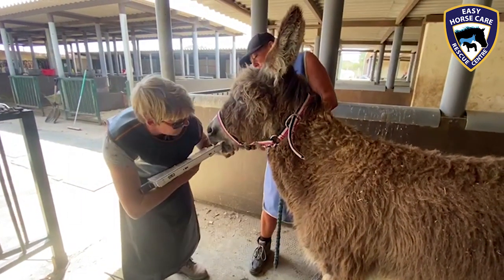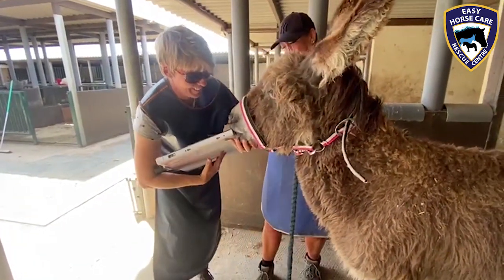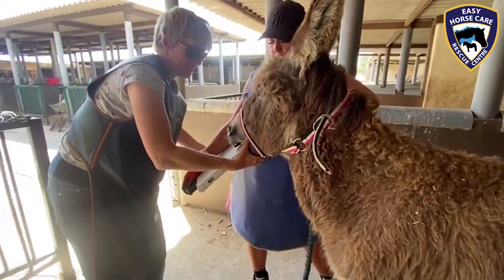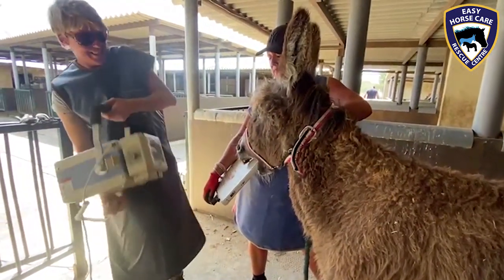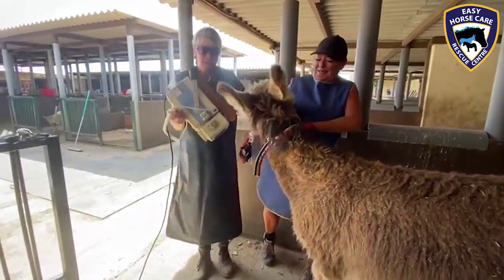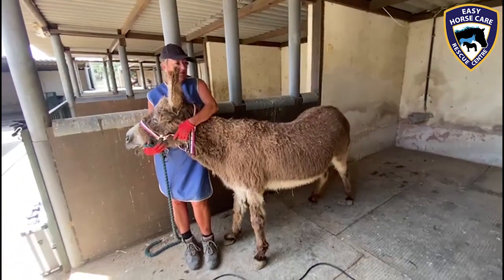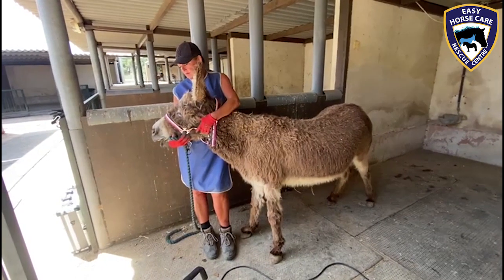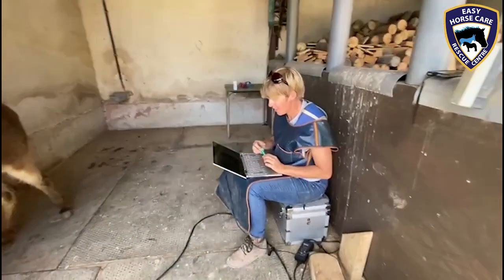As you can see it's quite a complicated procedure to get the x-ray plate into Marley's mouth to enable Dorothea to actually get an accurate x-ray of the root. We finally managed to get the x-ray plate into her mouth and mission accomplished — so what was the result, Dorothea?